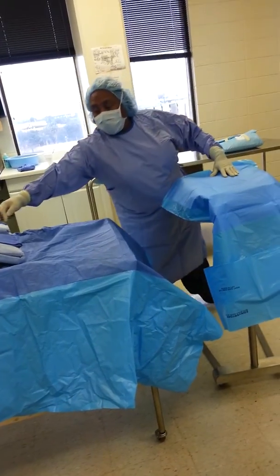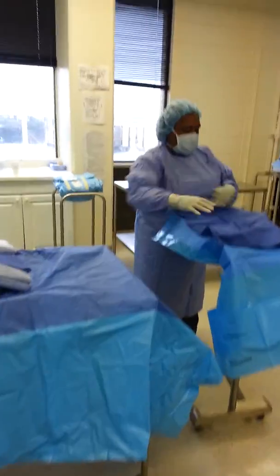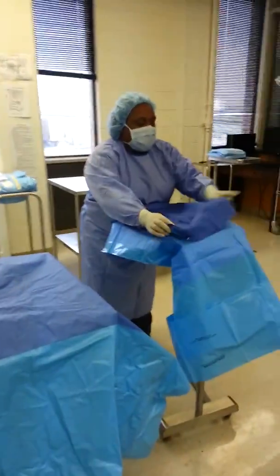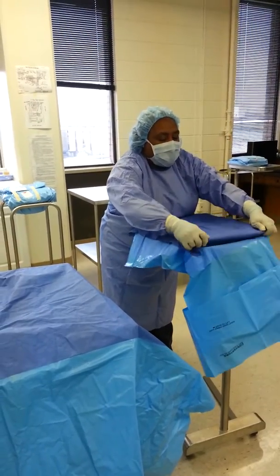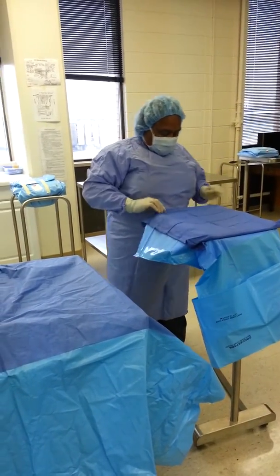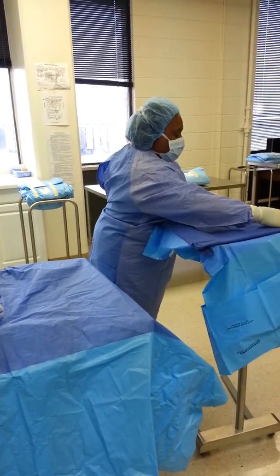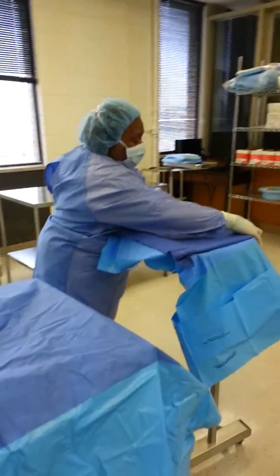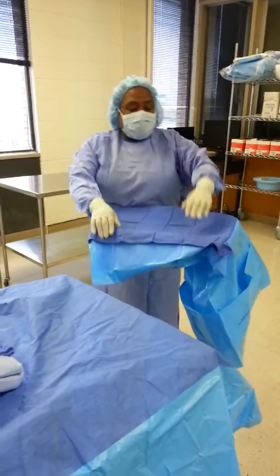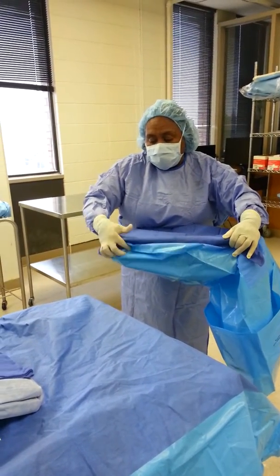I get a blue towel. I lift at the back, tuck. I lift at the front and tuck. And then I do my two sides. It's almost like making a bed. Mr. Goody is anal about this. Ms. Palmer isn't, but I do want to make sure all my corners are tucked.